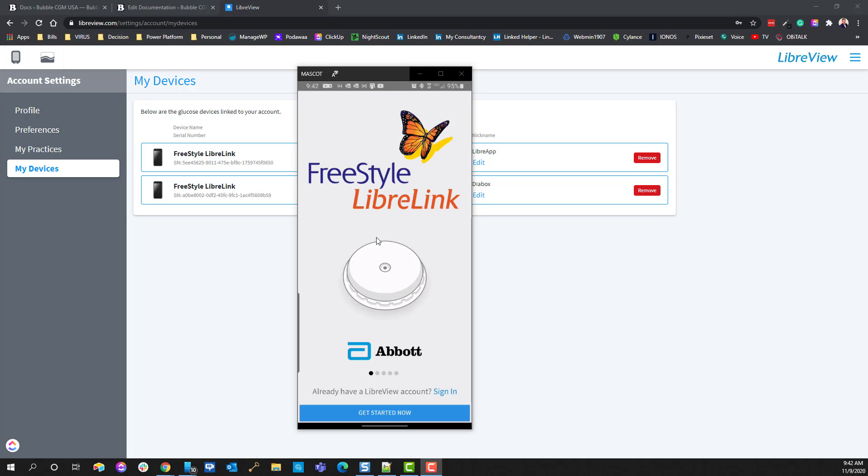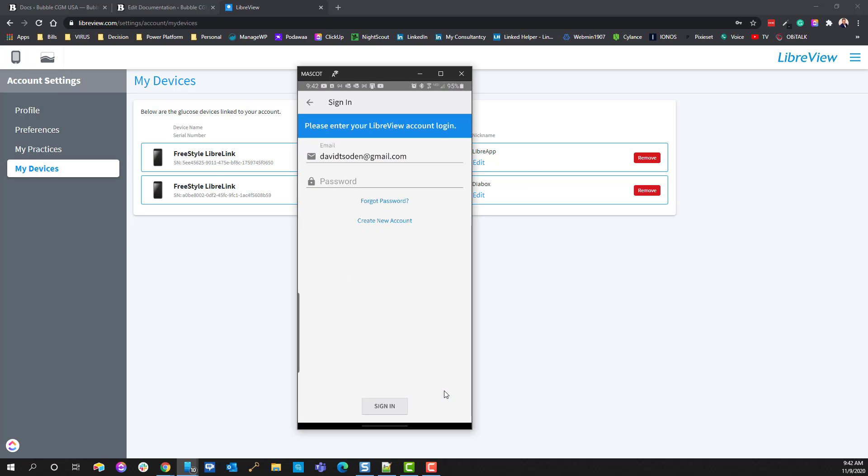Okay, so here is the Freestyle LibreLink app, and when you go to do a sensor change, you're just going to have to choose Sign In. You're going to have to put in your password, and then it'll do it, and then you'll tap the device, and it'll start it.